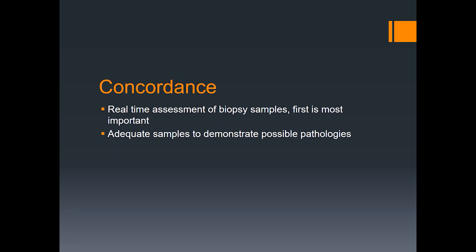We think about adequate samples in general, assuming the patient's tolerating the entire biopsy procedure to demonstrate the possible pathologies. And we always do a post-biopsy mammographic view when able to determine clip marker concordance with biopsy location. Occasionally for bleeding or other logistical reasons we can't, but that's suboptimal. And I try to do this in 100% of my patients where it's appropriate.